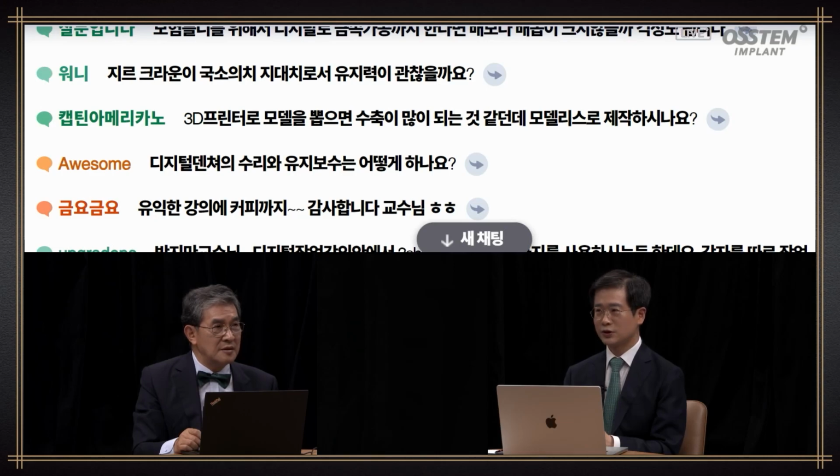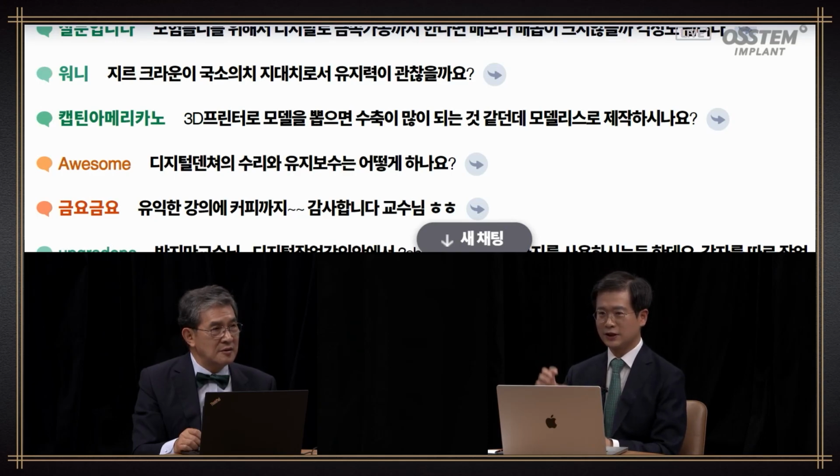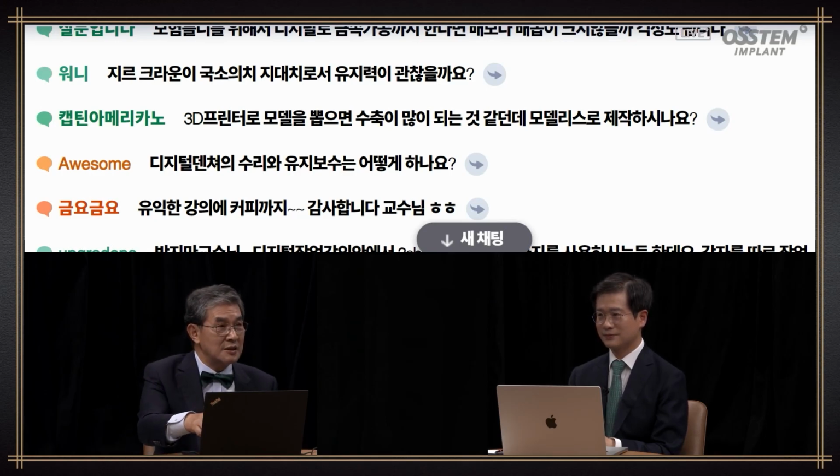Compared to metal, zirconia is harder. For the framework of a partial denture or single denture, if you put it up and down or remove it and put it in, I think retention is still okay. The metal might wear, so sometimes traces of metal are left there. You should be mindful of that.